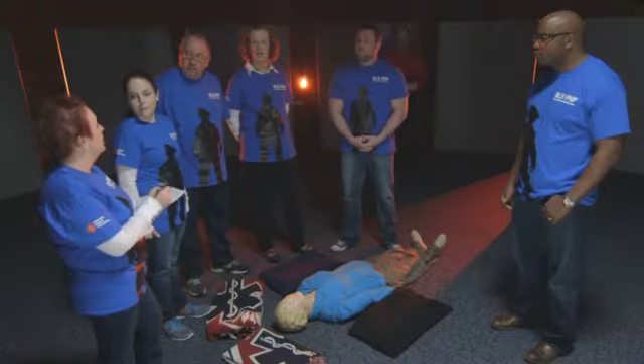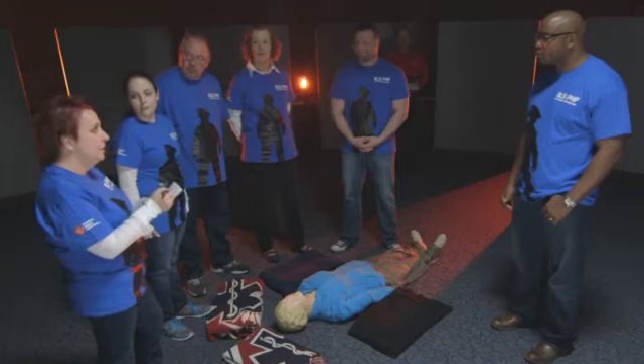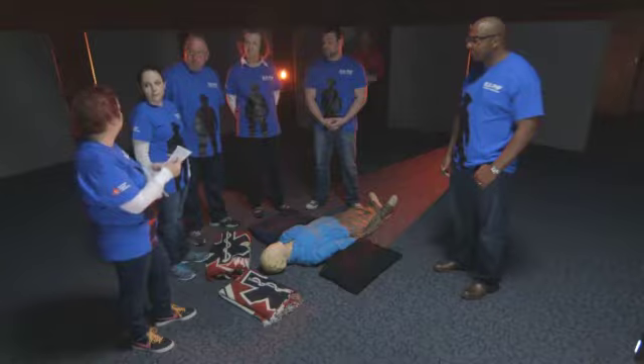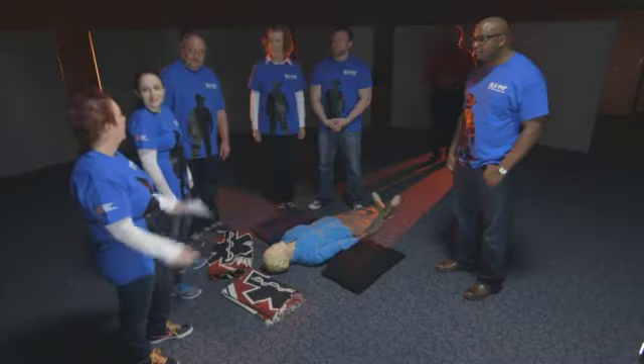Deb assigns roles: Joe J will be the bystander doing hands-only CPR. Jeremy, come in and assess and take over for the hands-only. Jeff, come in as the second compressor and bring the AED on scene. Joe, you'll be the ventilator. Ryan, be relief on compressions as well as help with ventilations if needed. And Steve, come in about a minute later and be our recorder — just let me know when you come on scene. Okay, let's go.